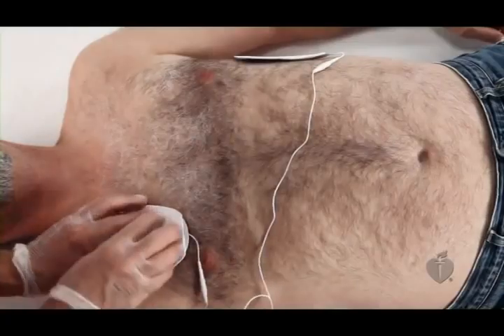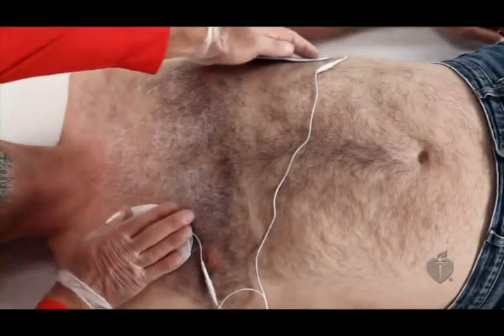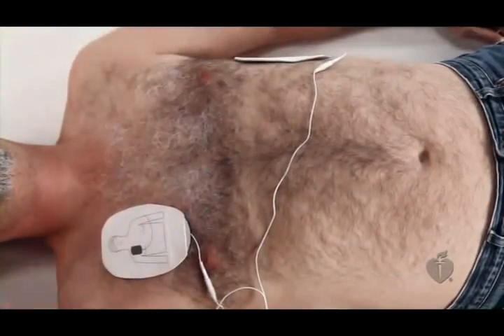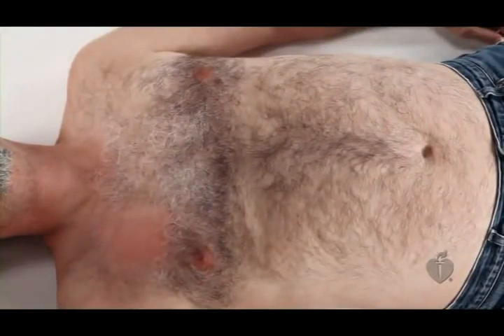If a victim has hair on his chest, the hair may prevent the pads from sticking. The AED may tell you to check the pads. If this happens, press the pads down more firmly. If they still aren't sticking, rip the pads off forcefully, removing the chest hair. Then reapply a new set of pads to the bare skin.